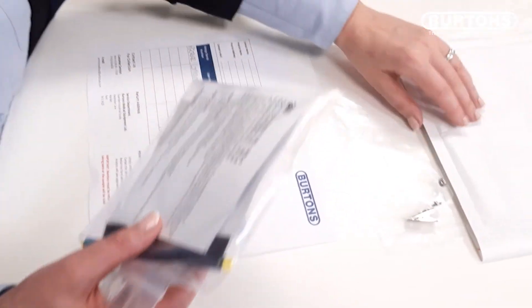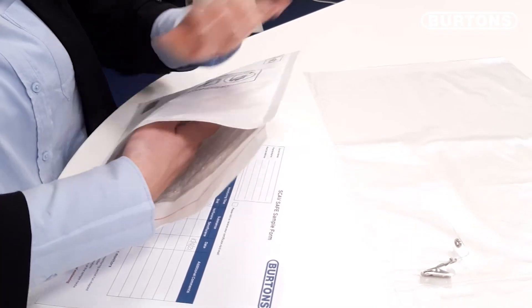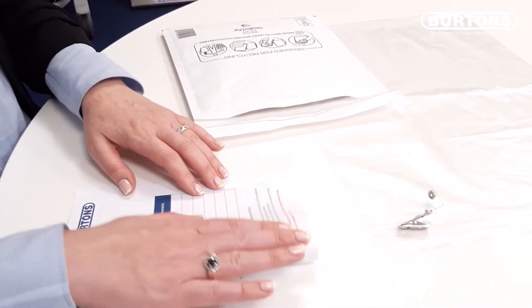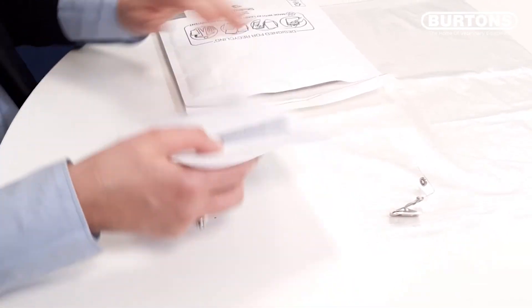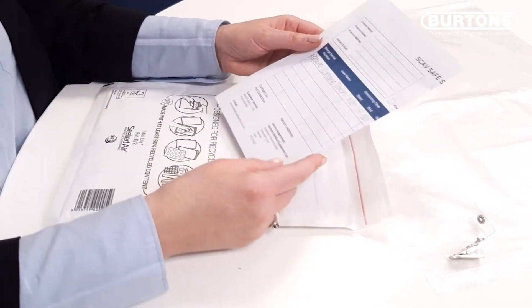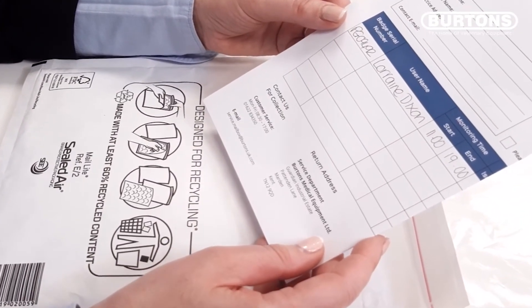Place your pouch into the return envelope together with your completed sample form. You then need to call Burton's service department for collection of your badge.